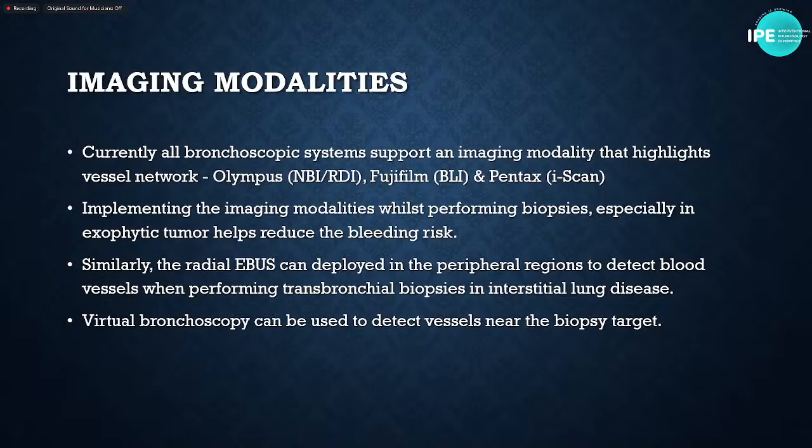Implementing these modalities helps you know where you can perform the biopsy, especially in exophytic tumors, where bleeding is the highest complication that you're afraid of. So you can always preempt the bleeding by applying an NBI or BLI or an iScan on the section where you want to take the biopsy, and then decide whether or not it's a viable position.